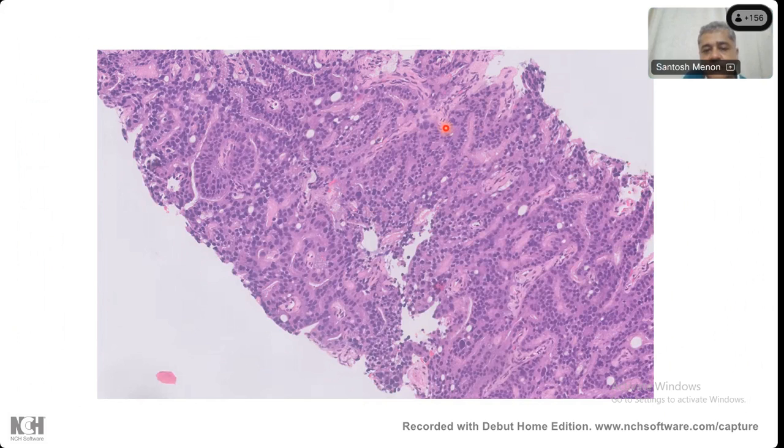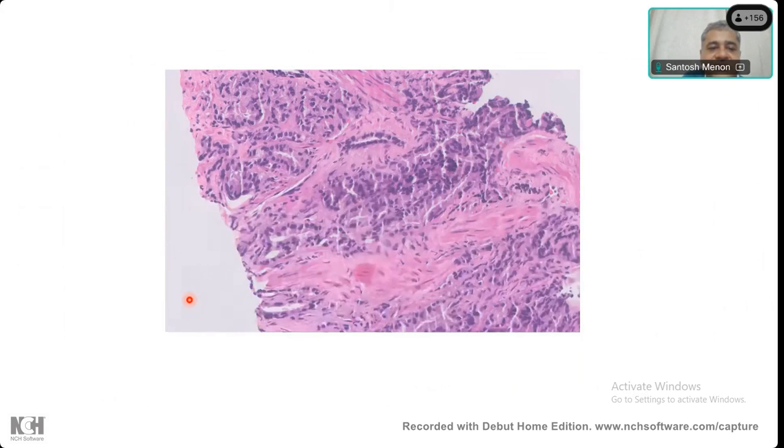Single gland, multiple glands, fused glands? Everybody agrees these are fused glands? Or maybe complex papillary fused glands? Fine? 4 plus 4. Difficult ones, again more difficult ones. Getting more. So again you have fused glands here, okay?